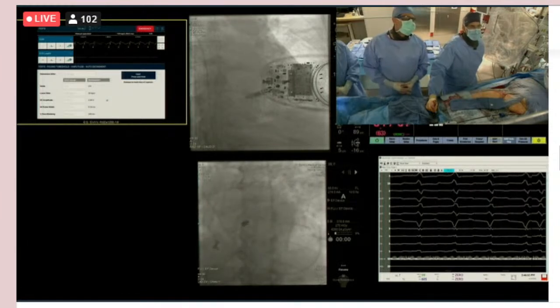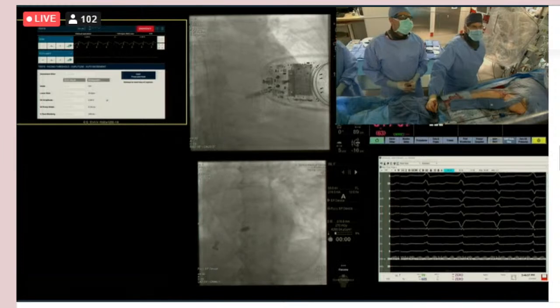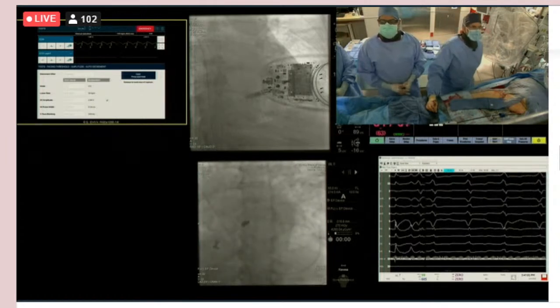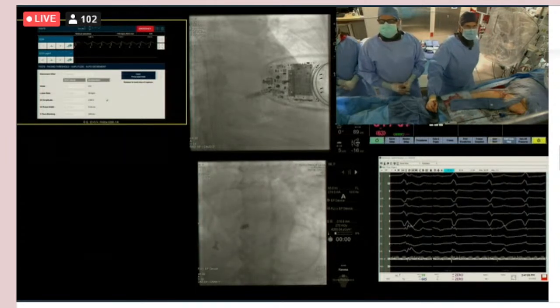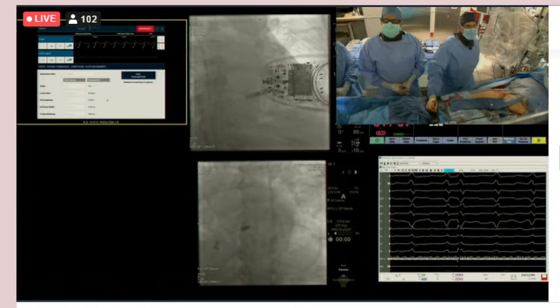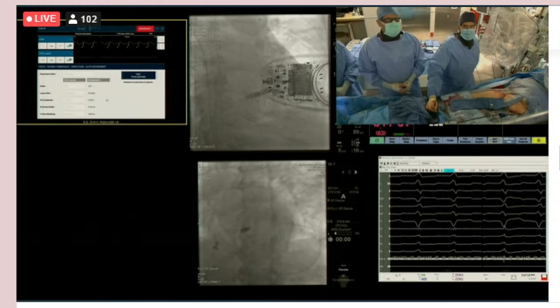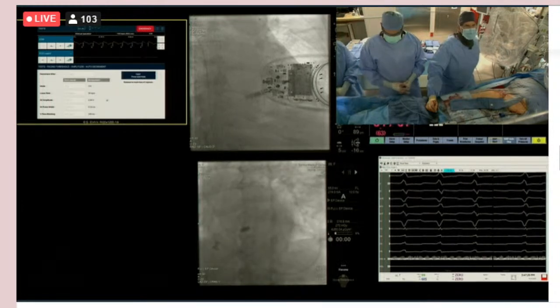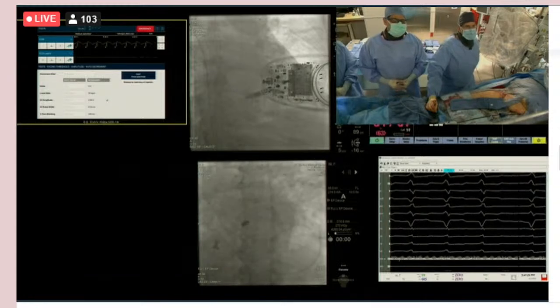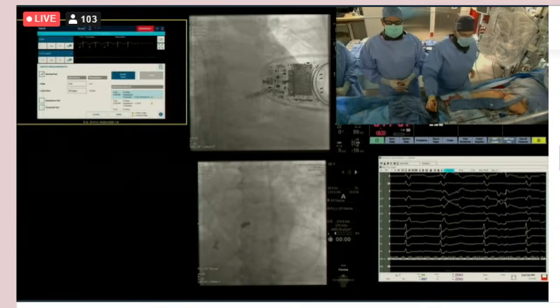So our numbers are getting a lot better quickly. 625. Yeah, we're coming down quickly. We're down, I mean, sub 2. We're sub 2 now. Sub 2, okay, that's good. Yeah, 1.5. But I noticed you've not done the tug test yet. I know, although the numbers are getting better, yeah. There's 1. So we're sub 1 already. Okay. We're 0.75, 0.63, 0.5, 0.5, 0.38, 0.25. There it is. So 0.25. So we'll do a tug test here.